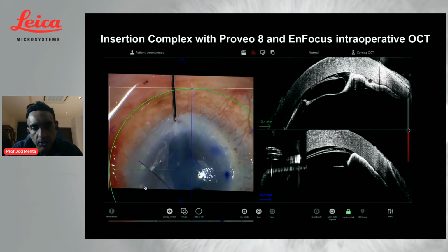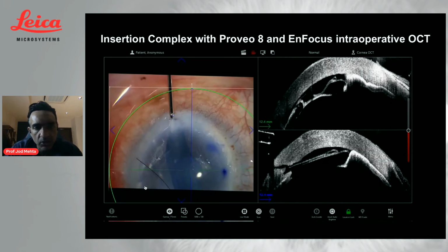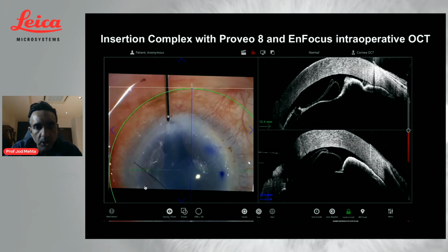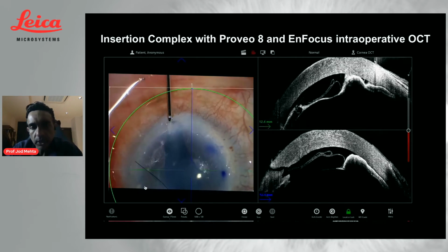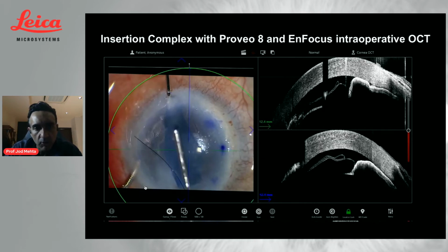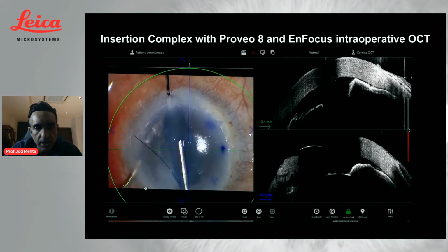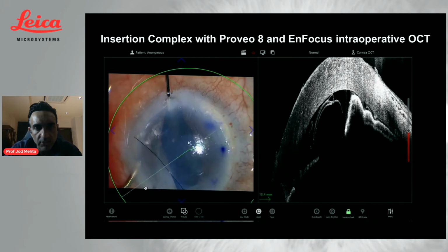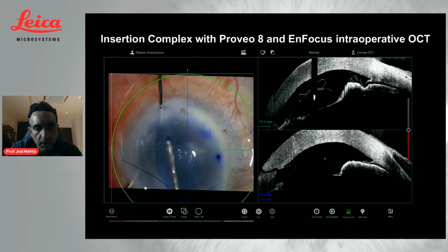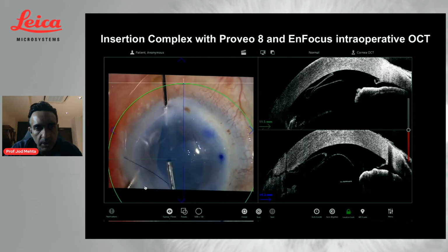And once you pull it in, you deepen the anterior chamber, not shallow it here. As you deepen the anterior chamber, you'll see that the graft will want to open up in its own formation itself. So by holding it in 27 gauge forceps, you have control. It helps you with the orientation of the graft and where the graft is going to sit in the anterior chamber. I'm just gently tapping to force the leaves open. So you can still see it's obviously still folded on the OCT. And as we deepen the AC, you'll see that one of the leaves will open up.